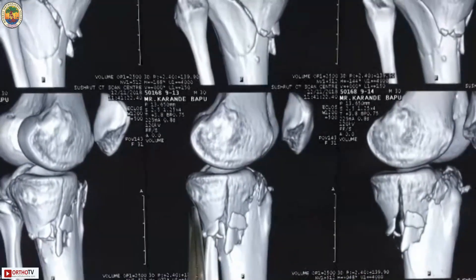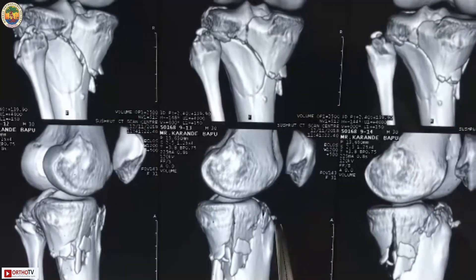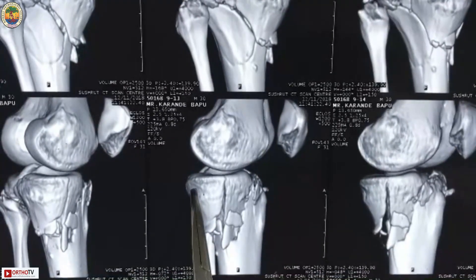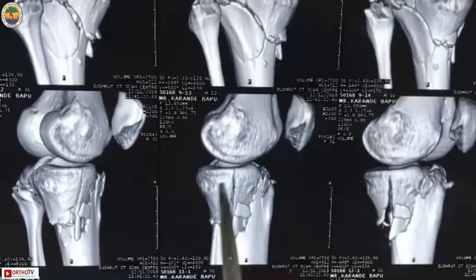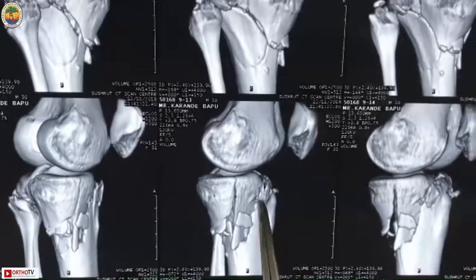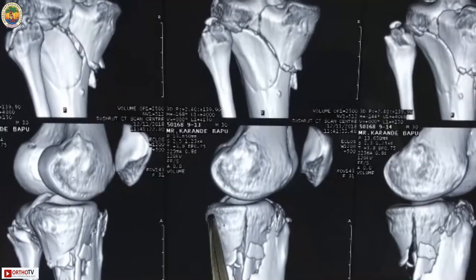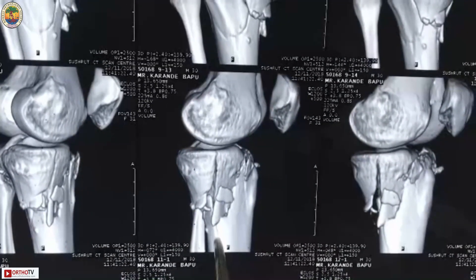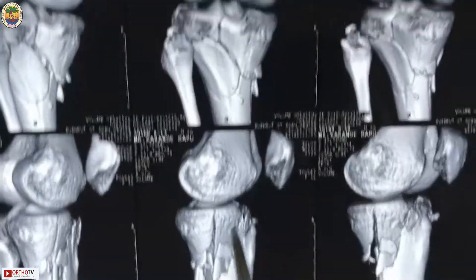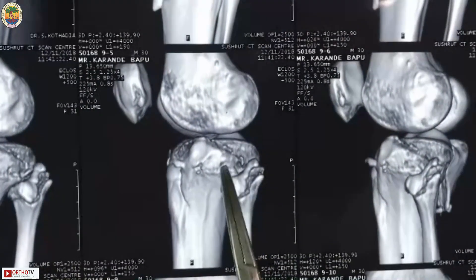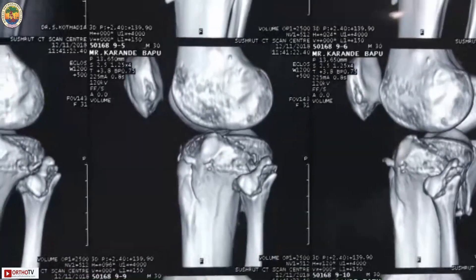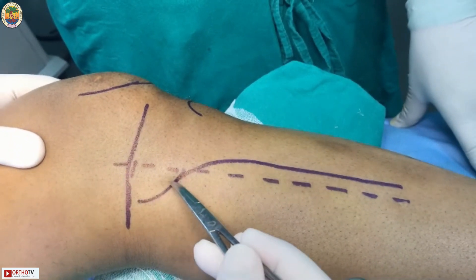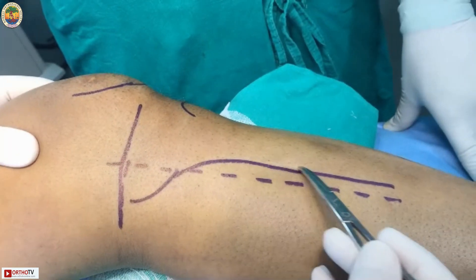For a patient with both medial and lateral condyle fractures, the preferred approach is posterior medial with the patient in supine position and the knee in a figure-of-four position. A posterior medial incision is made, the coronal split fracture is reduced, fixed with a temporary K-wire and one or two screws, then a buttressing plate is placed over the posterior edge of the tibia. The landmarks are the patella, joint line, and posterior medial border of the tibia.